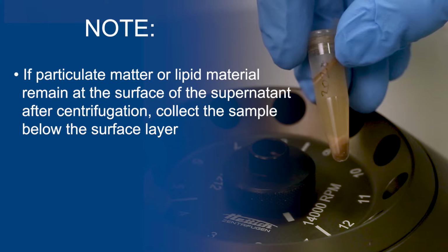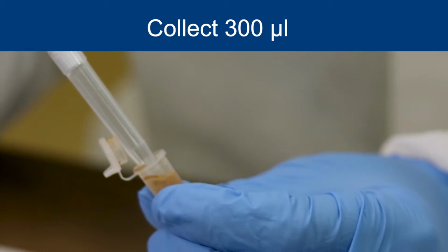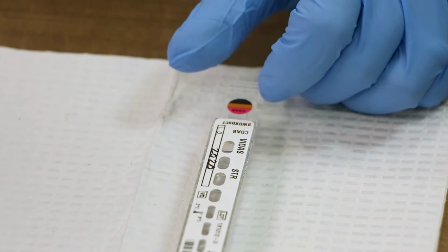Note, if particulate matter or lipid material remain at the surface of the supernatant after centrifugation, collect the sample below the surface layer. Using a pipette with a disposable tip, collect 300 microliters of supernatant and transfer it to the VIDAS C. difficile Toxin A and B test strip.